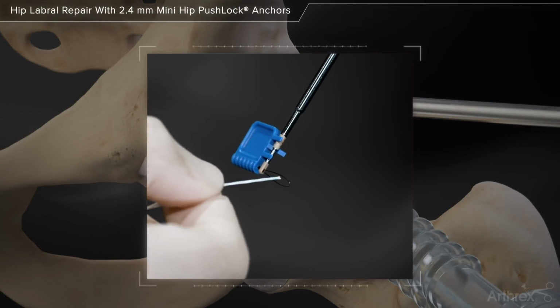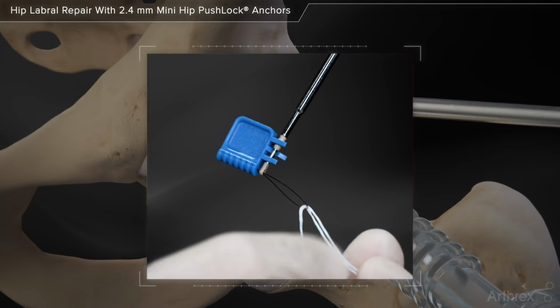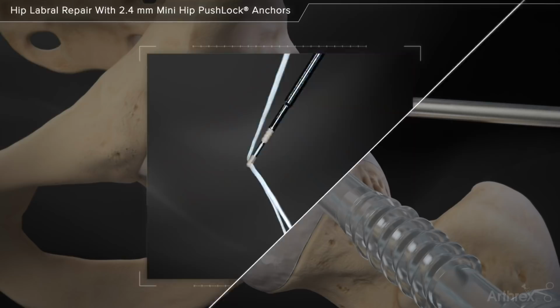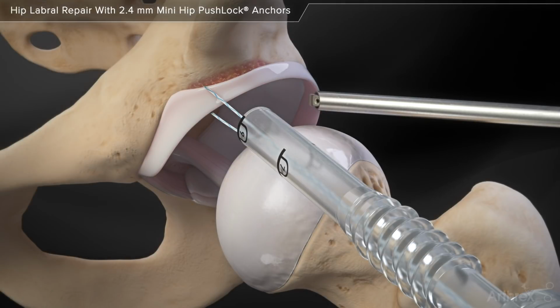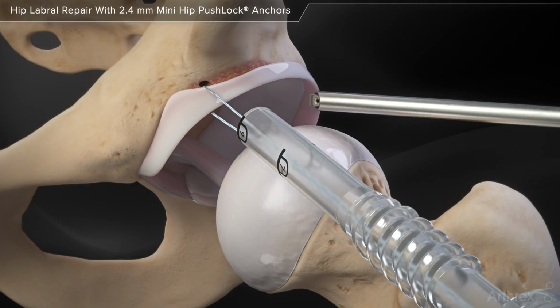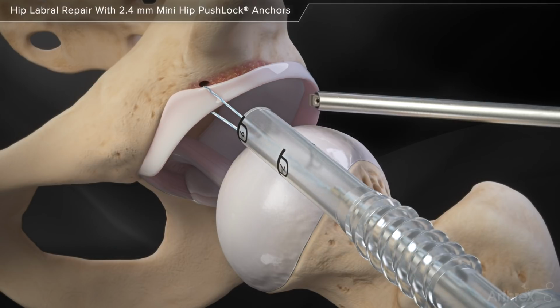The suture is disengaged from the Scorpion and the two suture tails are loaded through the PushLock anchor eyelet. The suture tails are clamped with a hemostat and a drill guide is placed along the acetabulum to create a pilot hole for anchor insertion. The drill guide is removed and the PushLock anchor is brought into the joint with the sutures under tension.